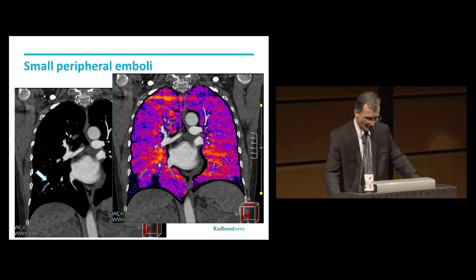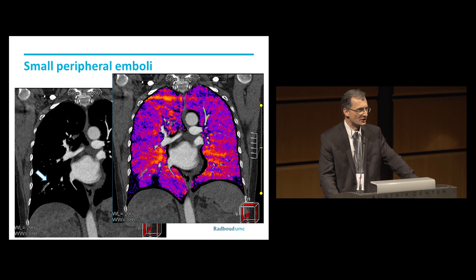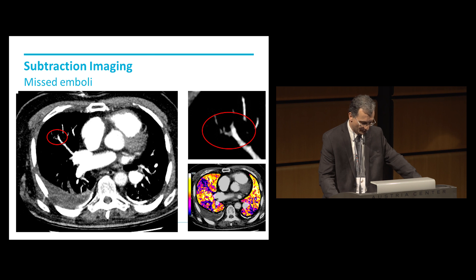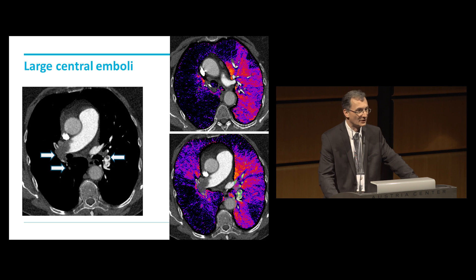Here are the coronal images. We see streak artifacts from the injection veins, which is very similar to the artifacts we see from dual energy, but the contrast-to-noise ratio is substantial. A classic situation where the image quality of a CTA is maybe not optimum — we actually missed this area here. But if you go back to the perfusion, we see that there's a defect and we could actually identify it later on.